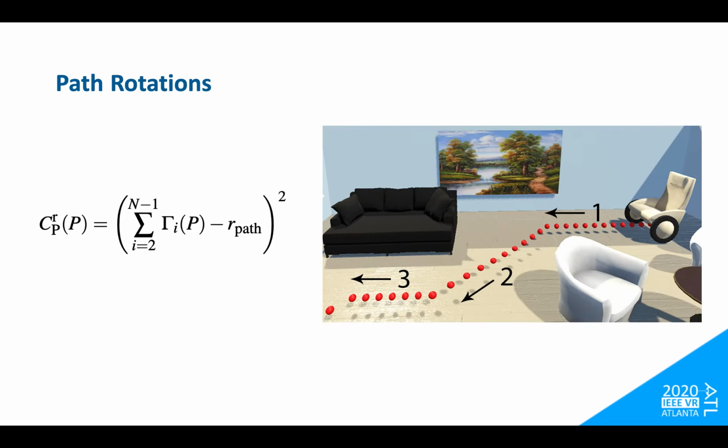With the rotation cost, the customization of the path rotation is vital for adjusting the simulation difficulty for a user. For example, if a user cannot navigate turns well, adjustments can be made to have the path gradually increase rotations until the user feels comfortable with turning.